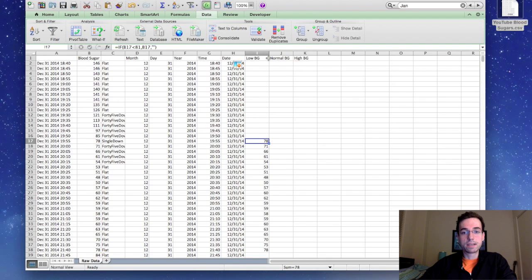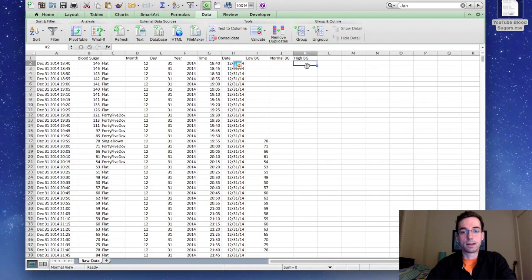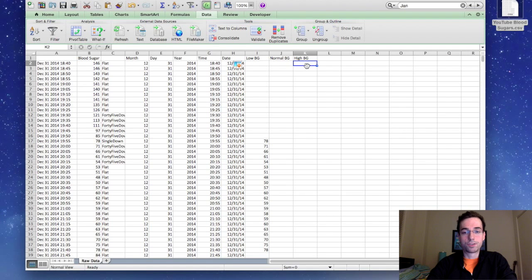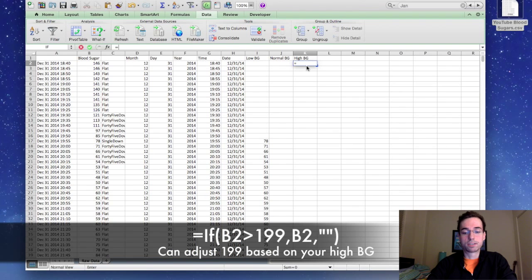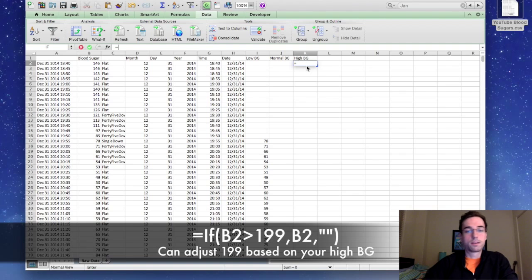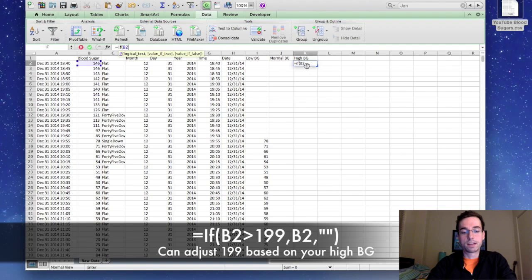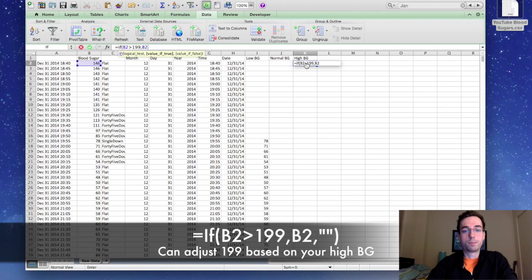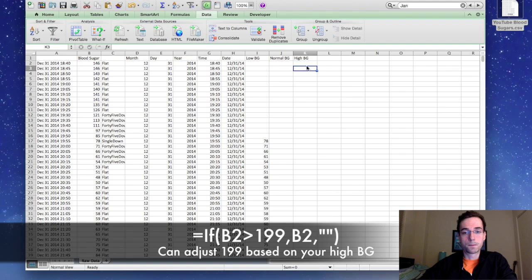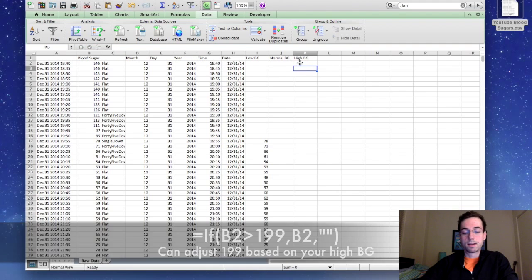We're going to skip the normal BG for now. We're going to input a high blood sugar reading. So the high blood sugar is going to say equals if B2 is greater than, and again, for me, 200 is high, so I'm going to say 199. Then you're going to input B2, and if not, you're going to put quotes.